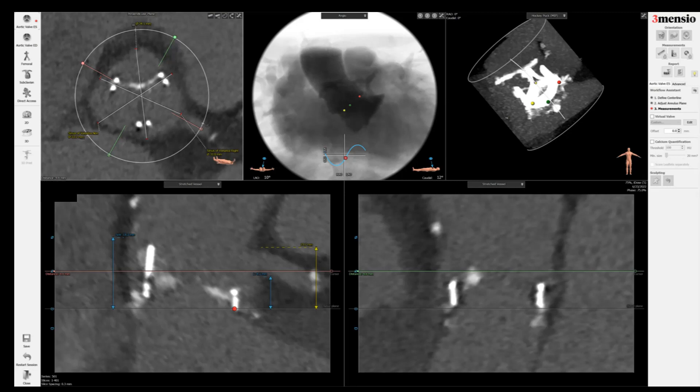Remember the aortic root is a little bit distorted as well, so sometimes it might not be as symmetric as a native aortic anatomy. The bottom line is you just put a line across to the opposite side and try to make it as symmetric as possible.